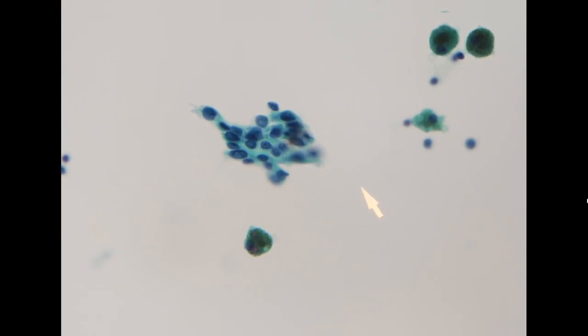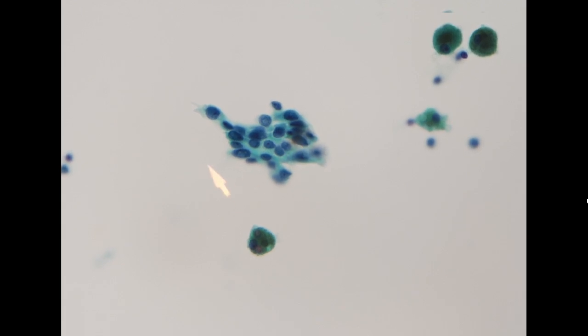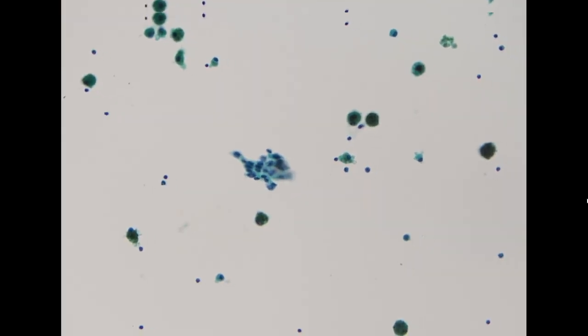So we will search for aggregates of epithelial cells. And what we see here is very similar to what we just saw in the thyroid aspiration. So this represents cells of papillary carcinoma. You can appreciate the nuclear inclusions here and there. So we do identify some epithelial cells here. This is consistent with our expectation.